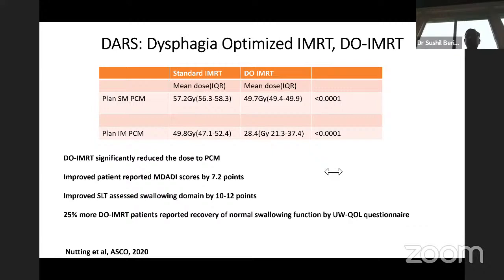Adaptive planning is an area of experimental research, I would say. You don't necessarily change a mucosal CTV, but somebody has 6 centimeter node and it becomes 4 centimeter. So there is regression of the node, anatomy doesn't match. Then you can change your CTV for the node accordingly, but you still cover that anatomical region, but you exclude the part which is out in air and outside the patient. So yes, you can modify the CTV for the nodal volume, but that is more for the regression of the node, but you still treat that anatomical region. But you do not modify a mucosal margin because that's not the goal of the adaptive.